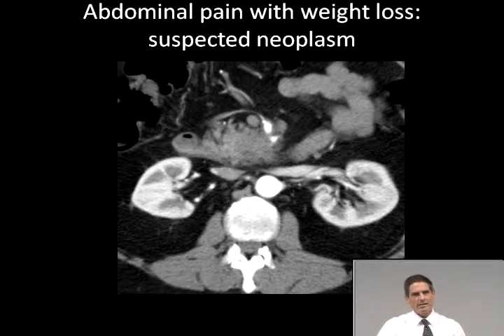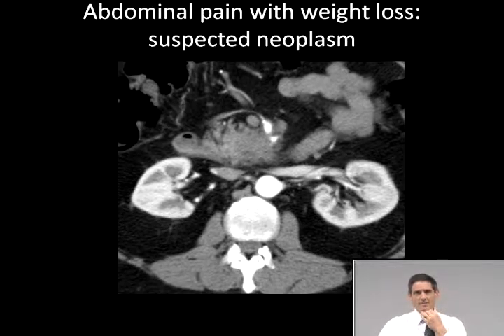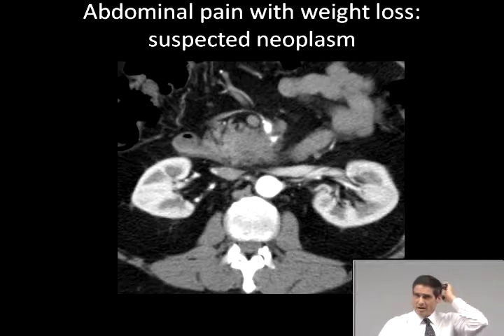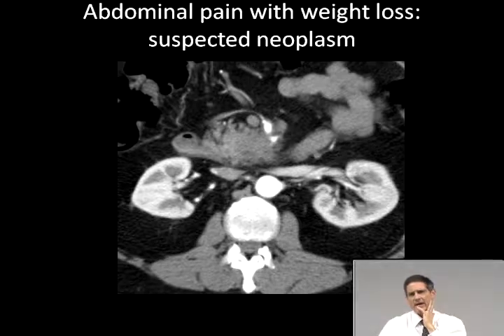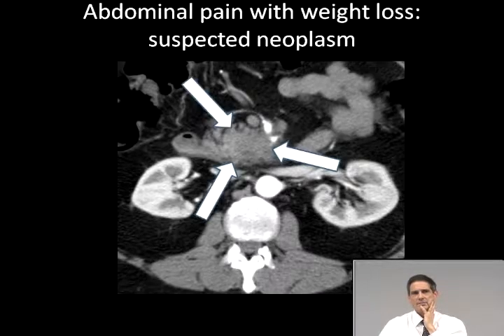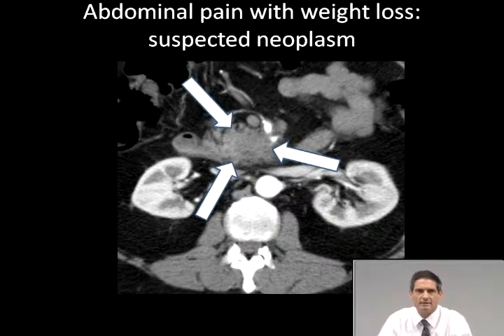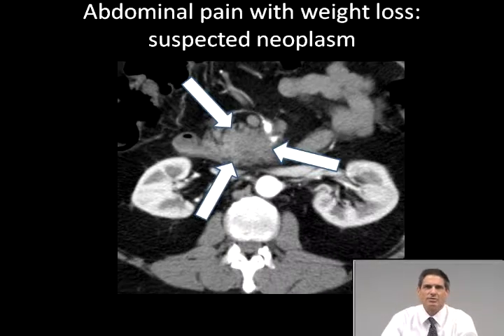Abdominal pain with weight loss — you really have to think about neoplasm. This unfortunate gentleman had abdominal pain and weight loss for several months and had an endoscopy done that was negative. He was sent for CT to evaluate for intestinal angina or ischemia and was found to have pancreatic cancer. At this point it had surrounded the superior mesenteric vein. He had a very poor prognosis and lived about another year to year and a half.